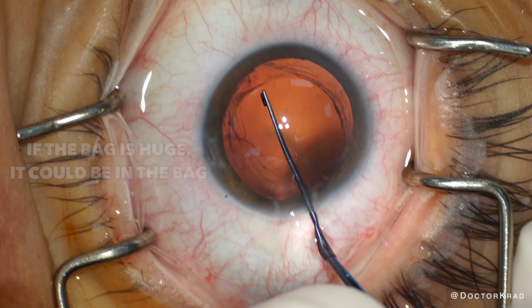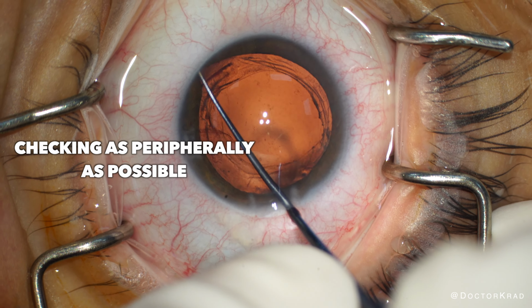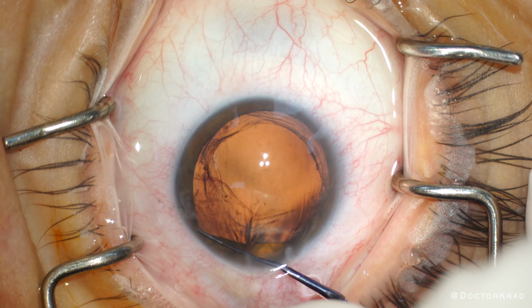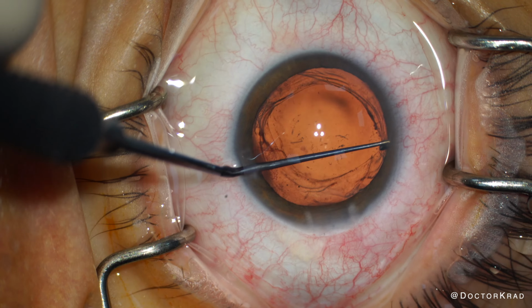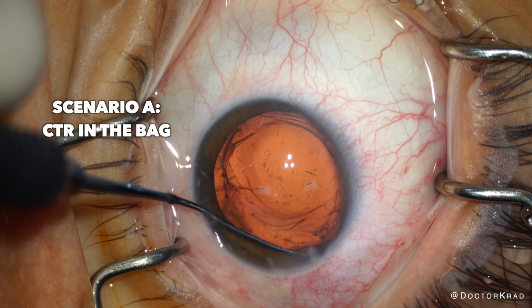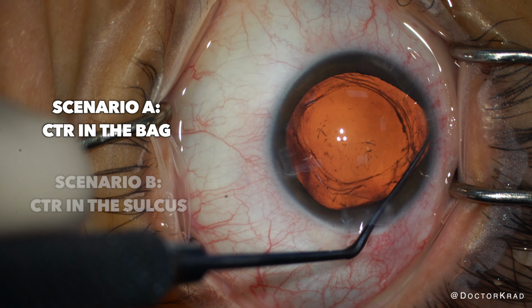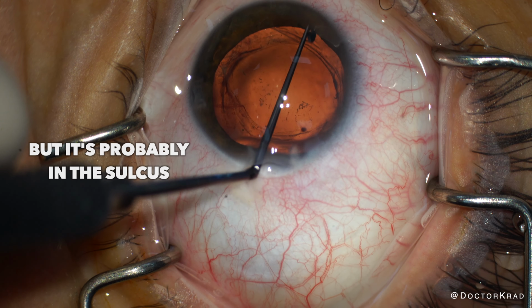If the CTR is in the sulcus, it would not be compressed, so it would be larger than usual. So it could be impossible to see unless you use ultrasound. But in my search, I don't see it. So it's either in the bag, and if it's in the bag, great, but I don't see the eyelets. Normally you can see the eyelets when you push the iris out that far. Or it's in the sulcus.